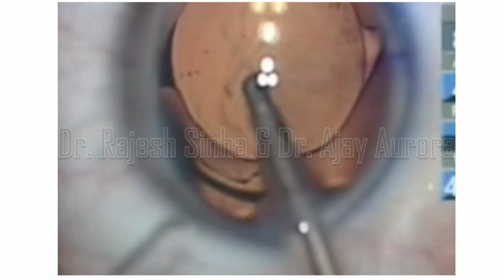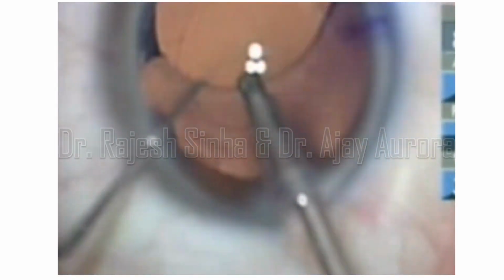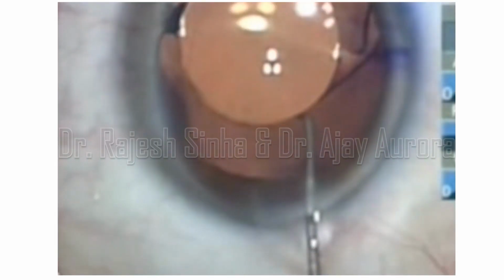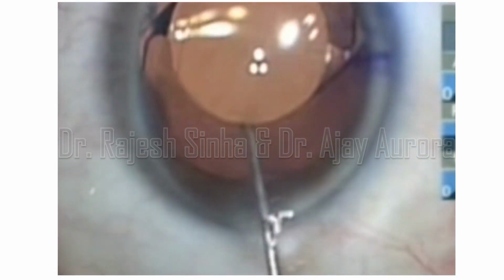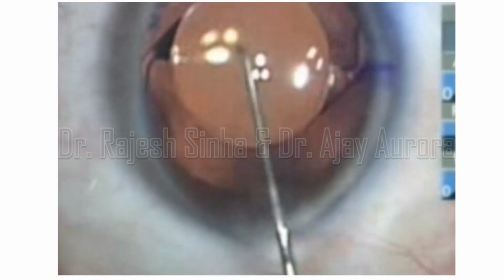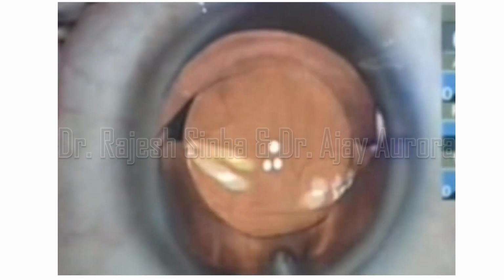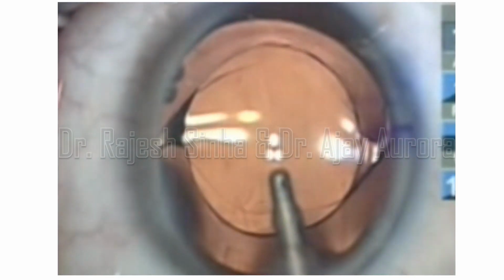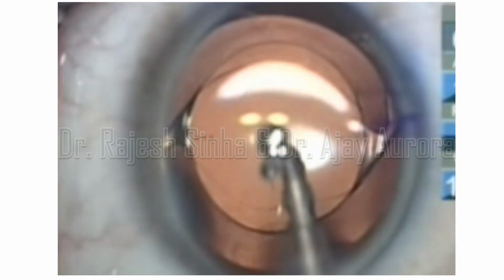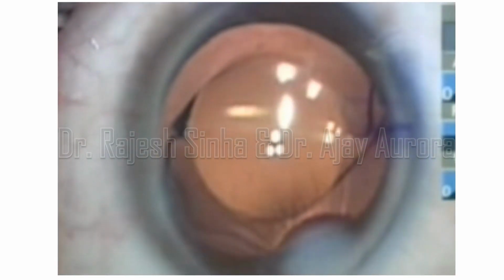And a special case of a megalocornea wherein the bag is large, so if you put the IOL it will sink a little bit down, it will get decentered, it will move. So what you can do is a reverse optic capture. The haptic is in the bag and the IOL optic is pulled up above the anterior capsulorhexis, and then you align the mark on the cornea with the mark on the IOL, and it remains stable. As you can see here, it is well captured in the anterior capsule.